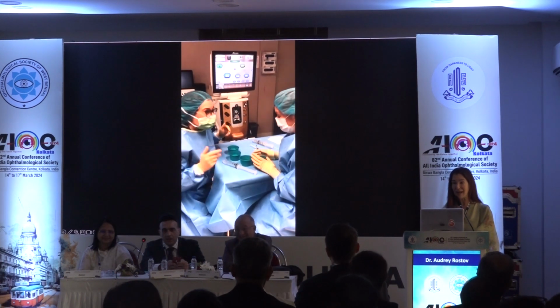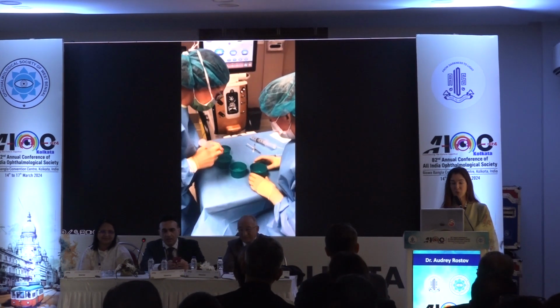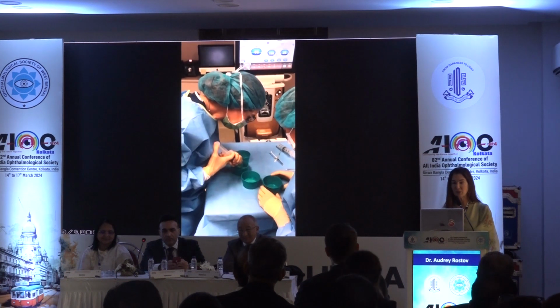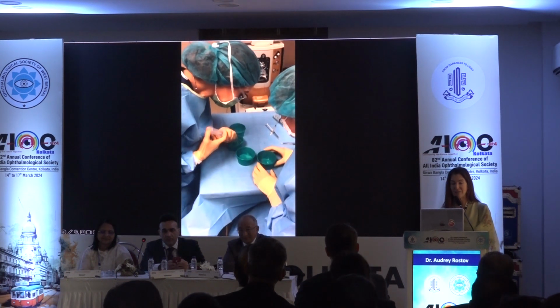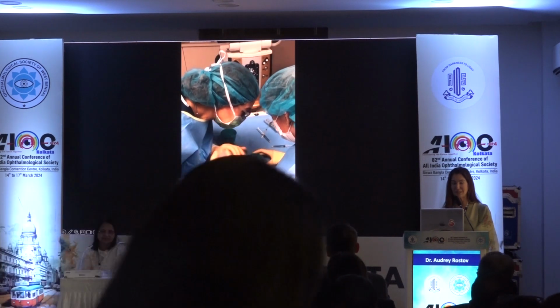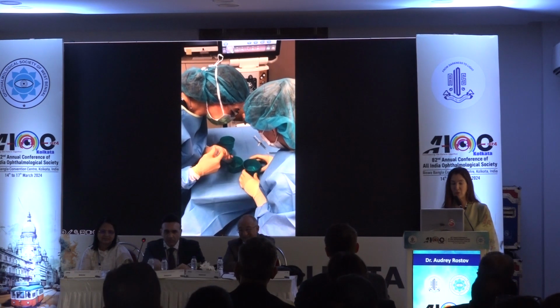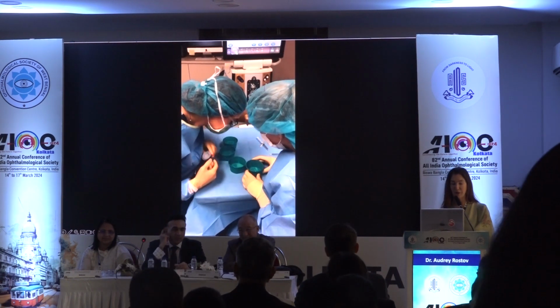This is a reenactment of actually what we did. We took the fluid out of the drape pocket and put it into sterile bowls, and that's how we eventually found the DMEK graft. We still didn't see it, but then we added trypan blue to the little bowls and then figured out where it was.